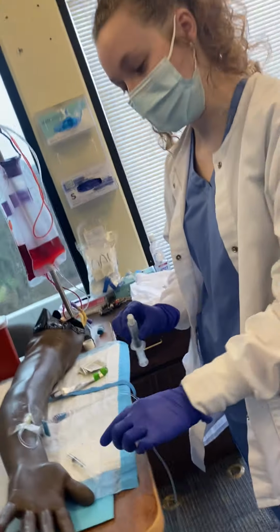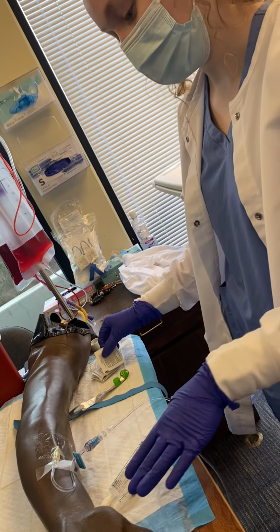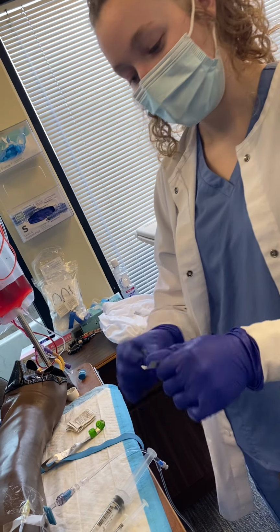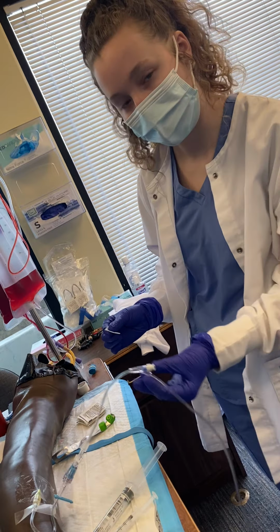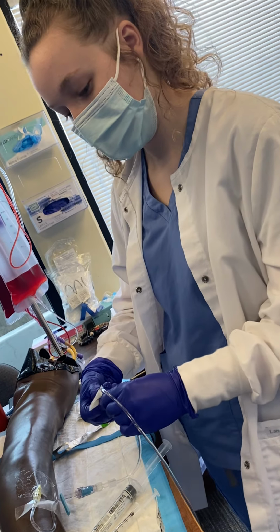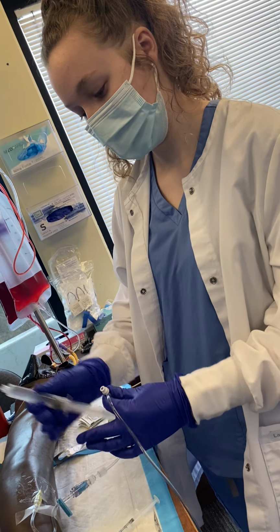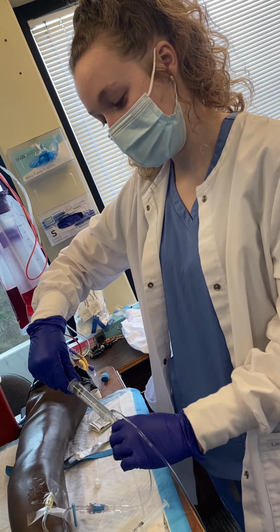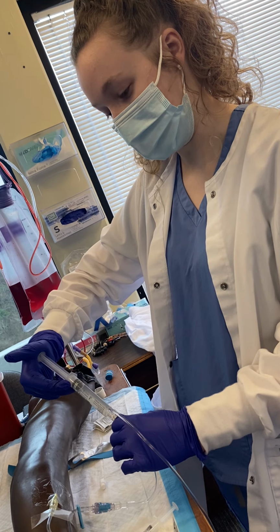And I've gathered all my supplies. So I have a flush, the medication, and verified again that that is the right medication, the right patient, and all that. So I'm going to take an alcohol swab, and I'm going to use the port closest to the patient, and I'm just going to wipe that off. And then I'm going to take a flush. I'm going to pull back to make sure I get blood return, and then push my flush.